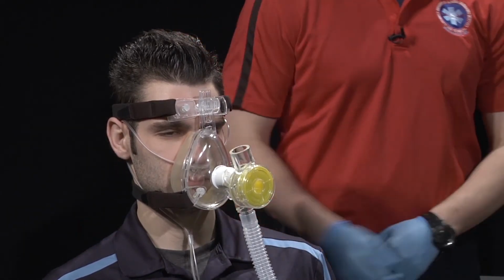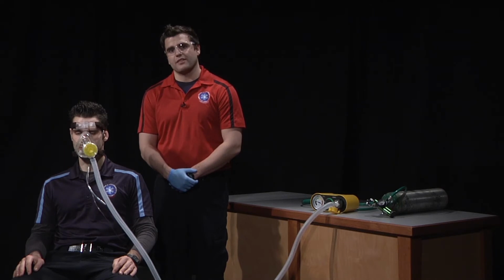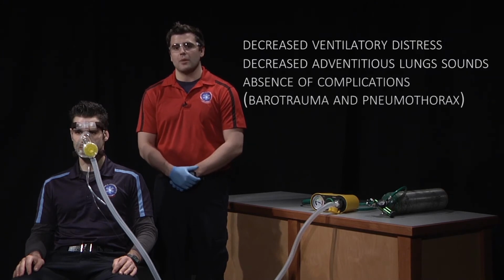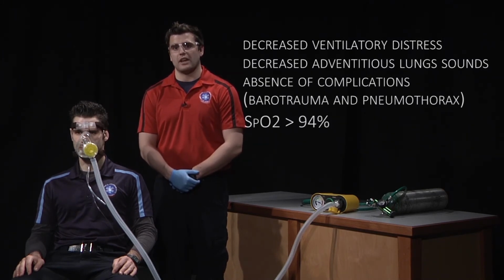After the CPAP mask has been placed appropriately, we're going to frequently reassess our patient for desired effects, such as decreased ventilatory distress, decreased adventitious lung sounds, absence of complications such as barotrauma and a pneumothorax, and an SpO2 greater than 94%.